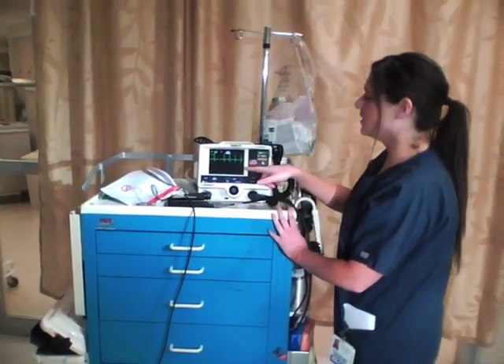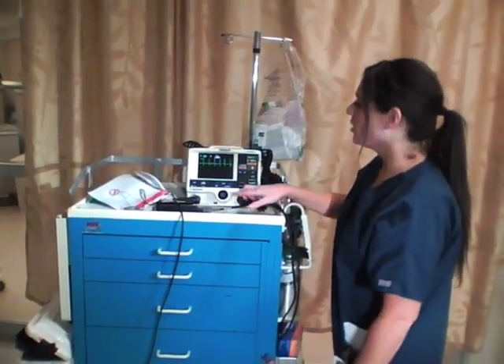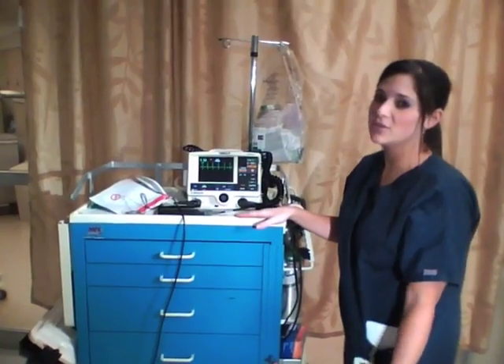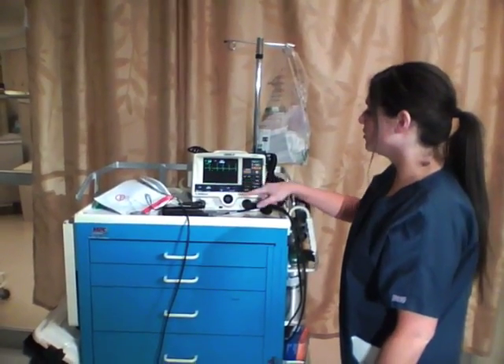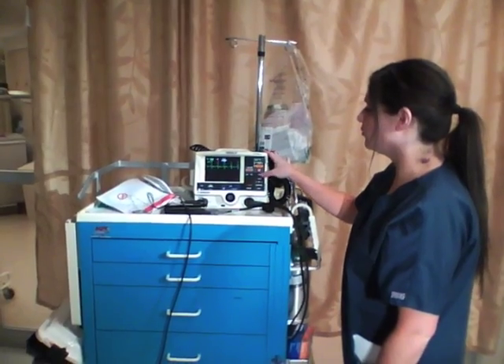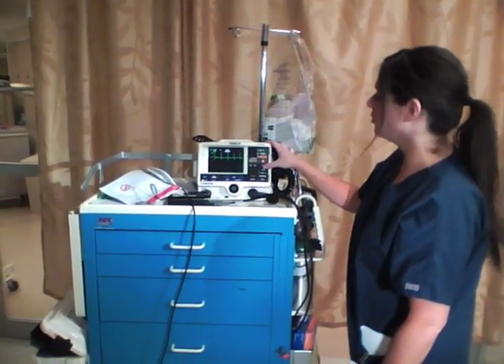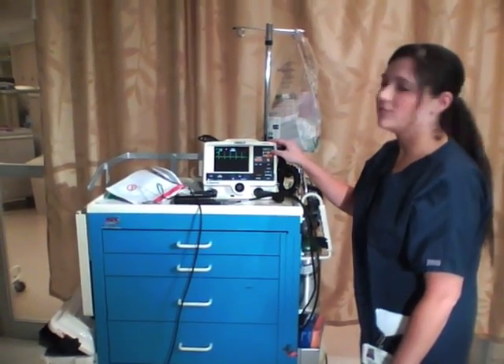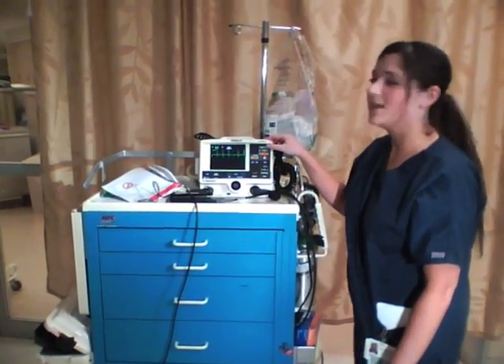Now you can see that if you needed to deliver a second shock, the sync button is gone — the little triangles are gone because we already delivered the shock. So if the patient needs a secondary shock, you always need to remember to press the sync button again, or else you'll be defibrillating them. If anybody has any further questions, you can ask me right now.